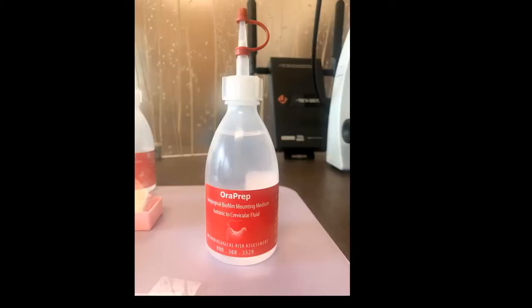We're using ORAPREP as a mounting medium. It's specially designed for this as it's isotonic to crevicular fluid. In a pinch, you can also use the patient's own saliva.